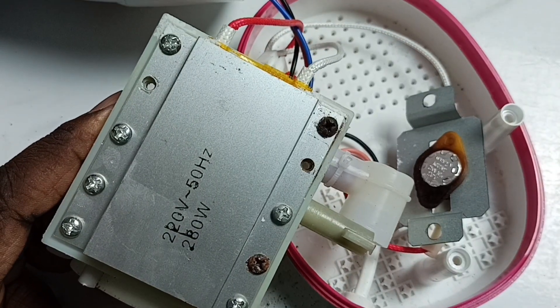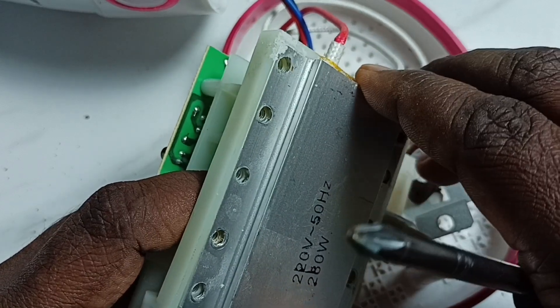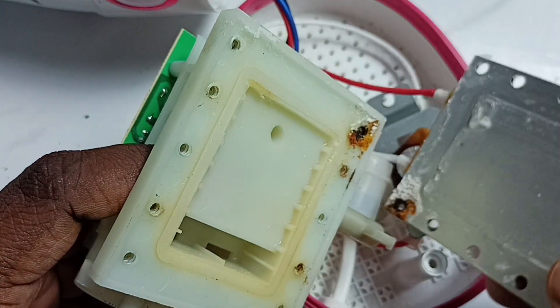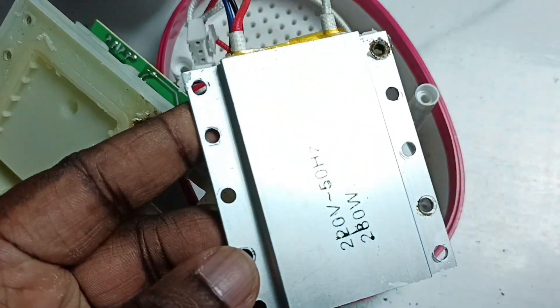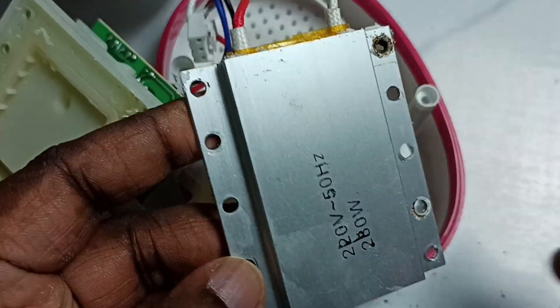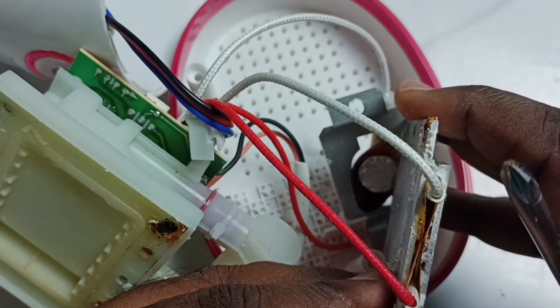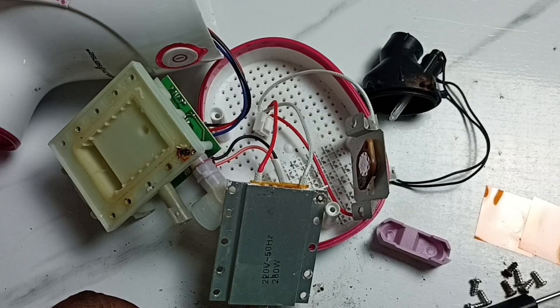Let me remove all these screws — done. Now I have removed all components of this Healthsense vaporizer.